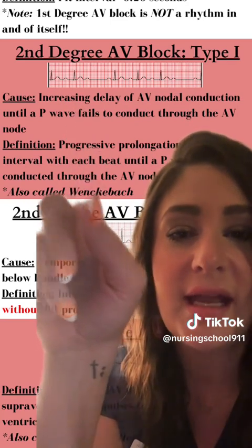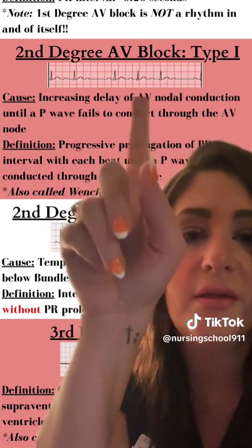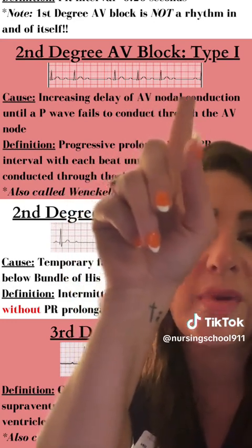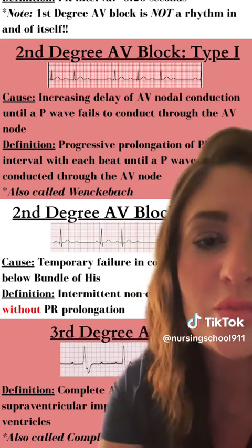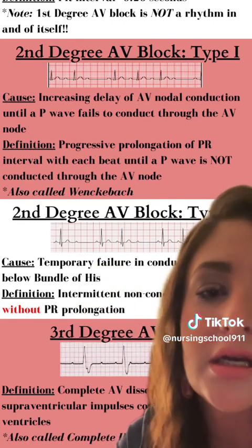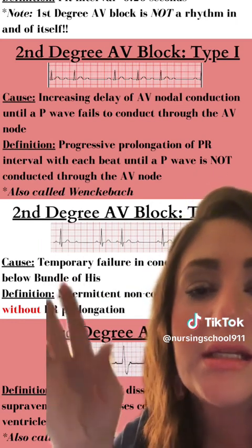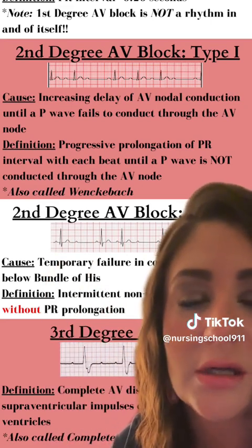And so you can kind of see that in this strip up here. Look at this complex right here, and then the very next one, the PR interval's getting longer, and then in the next one, the PR interval's getting longer, and then boom, we're dropping a QRS complex. So you have progressive prolongation of the PR interval with each beat until a P wave is not conducted through the AV node, and you see that as loss of a QRS complex, okay? So PR is getting longer, getting longer, getting longer. Then we drop a QRS complex, all right?